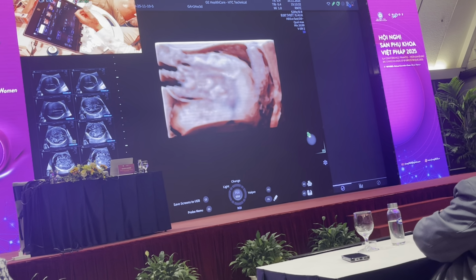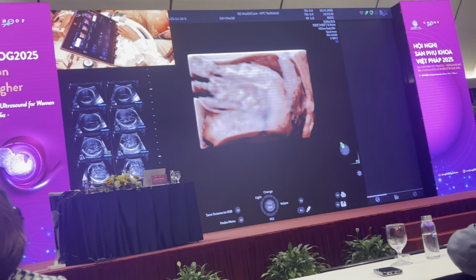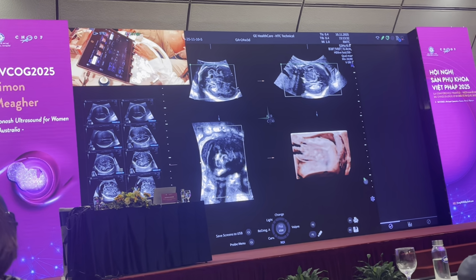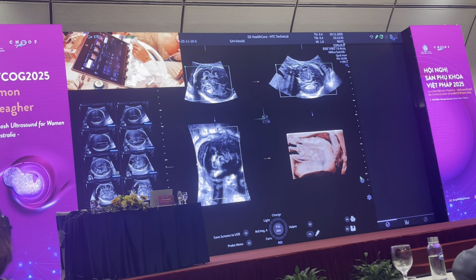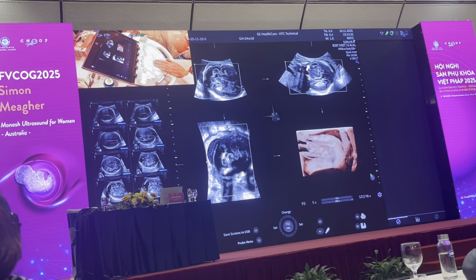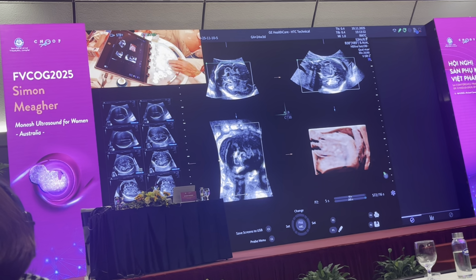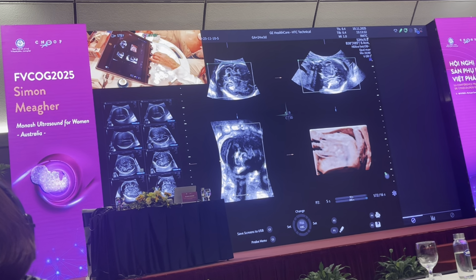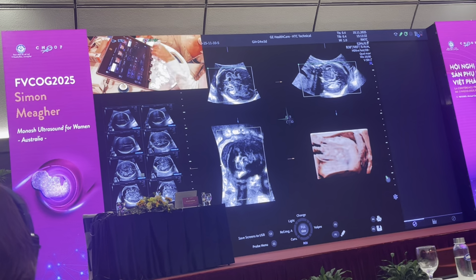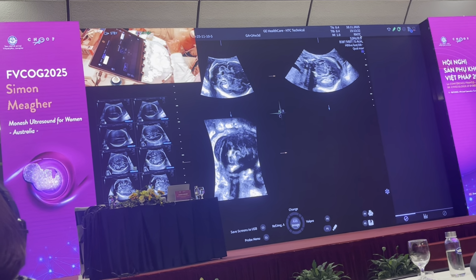So the next thing that I want to do is look at the fullness of the baby's posterior fossa, because the cisterna magna is increased. When I look at my volume, before I analyze it, I look at the B plane to see whether there are any motion artifacts. And it looks okay to me. I go on to do a render of the posterior cranial fossa. I want to do multiplanar.